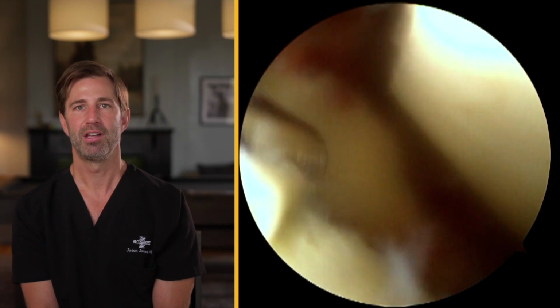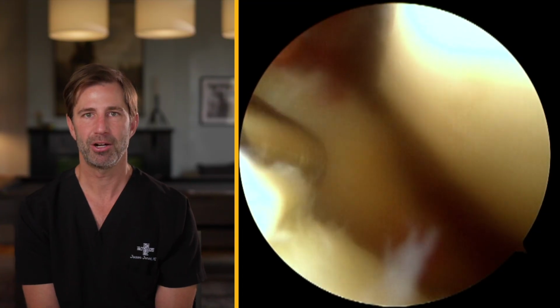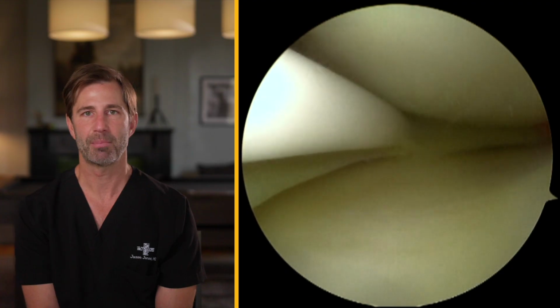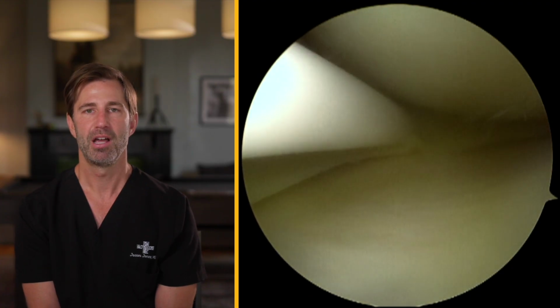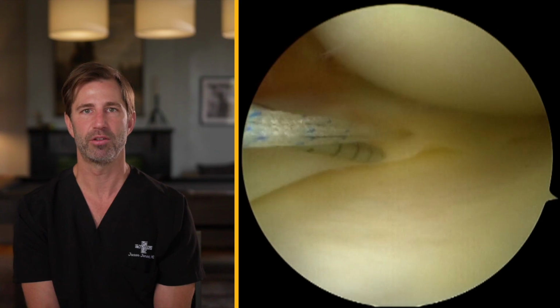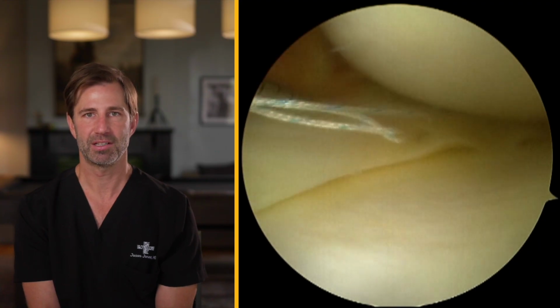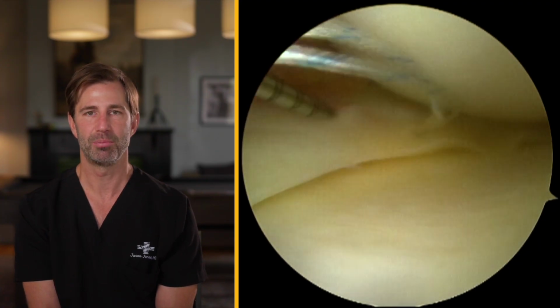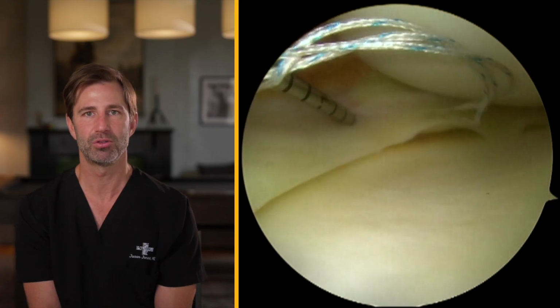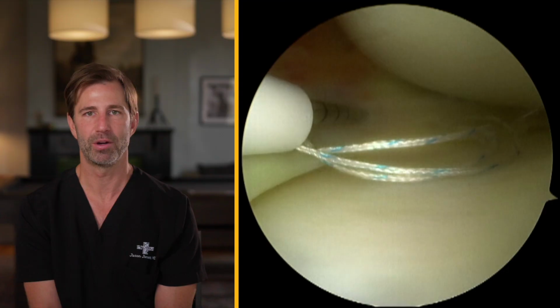Occasionally, patients suffer from what's called a bucket handle tear. This is named because the tear extends not only to the back, but around to the front of the meniscus. The remaining structure of the meniscus then flips into the joint and resembles the handle of a bucket. This is fixed in the way that we reduce the meniscus back into place, and then there's surgical sutures we can use to stabilize the meniscus within the joint.